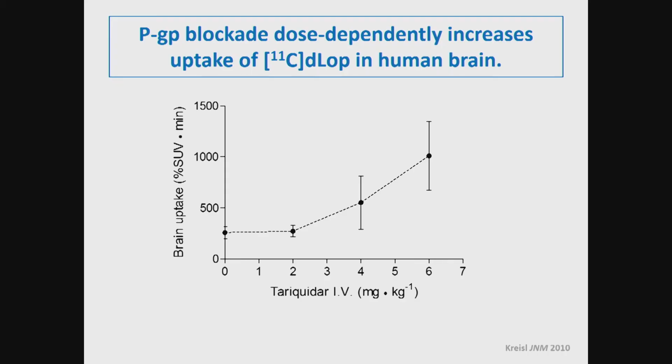And that's shown here. The brain uptake is increased with this inhibitor in a human just like it is in a monkey. So it suggests that for those tumors that could have increased PGP, you could potentially increase the uptake of the cancer chemotherapy agent into the tumor, or you could increase the delivery of the drug to the brain with a PGP blocking agent. In any case, I found this a very fascinating study to show how PET could study an important regulator of distribution, in this case the PGP efflux transporter, which blocks the entry of those drugs which are substrates in many tissues in the body.